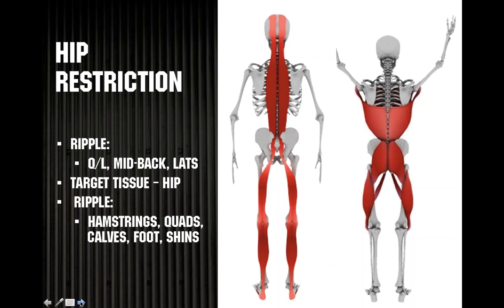Opposingly, if I'm looking at this functional line and somebody has hip pain, am I treating lateral thigh tissue, hamstring tissue, and also opposing lat tissue or thoracolumbar tissue? So I like to tell people within the course that I'm going to show you tooling techniques to mitigate pain, to increase sensory awareness, and or maybe to actually make mechanical changes. But if you don't get your changes, let's readdress.